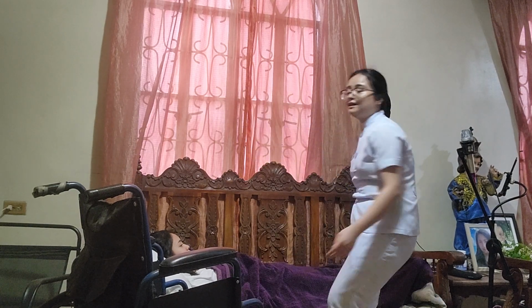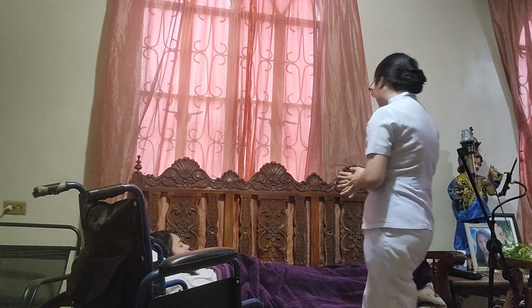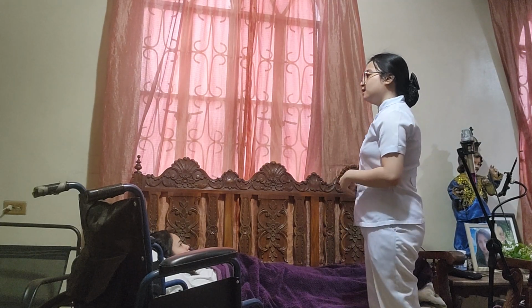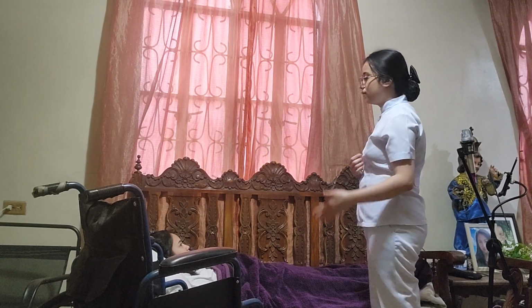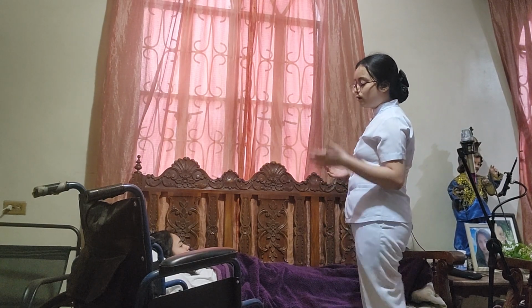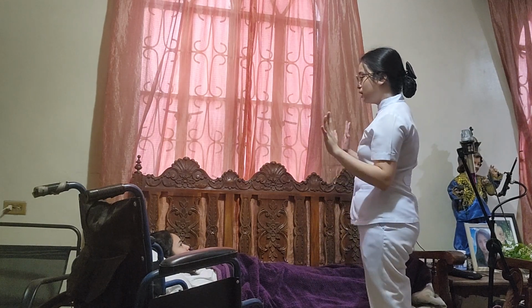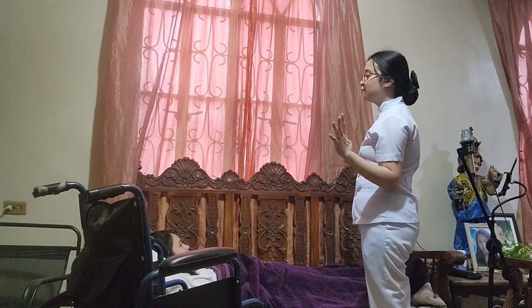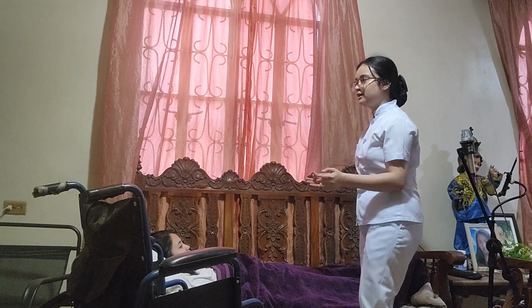After that, you will need to explain the procedure to the patient. So, ma'am, Dr. Cordova has ordered that you will need to go to the X-ray room for some tests. I will be assisting you. I will be transferring you to the wheelchair po. I'm asking for permission po to touch you. Is that okay po? Okay po, thank you po.